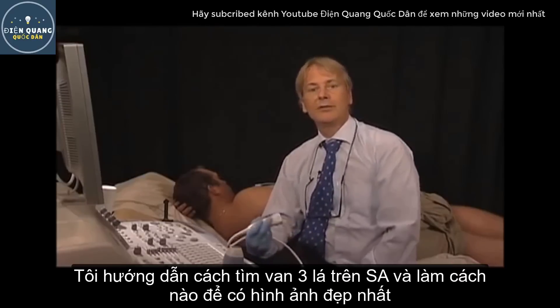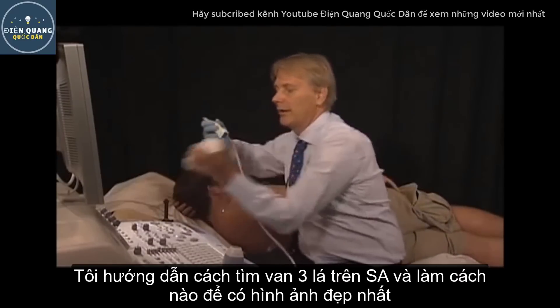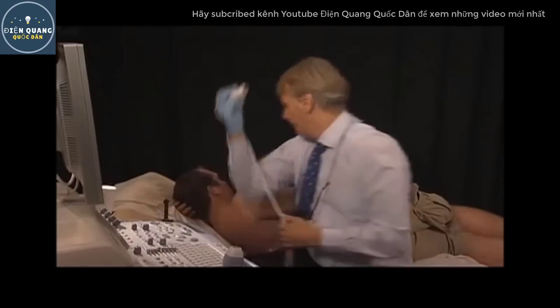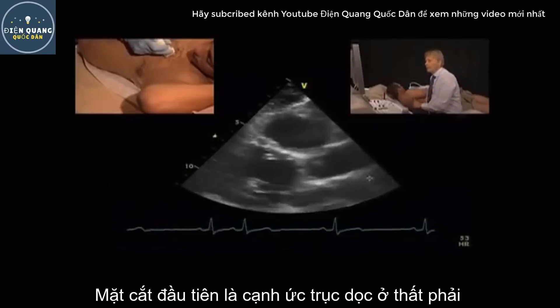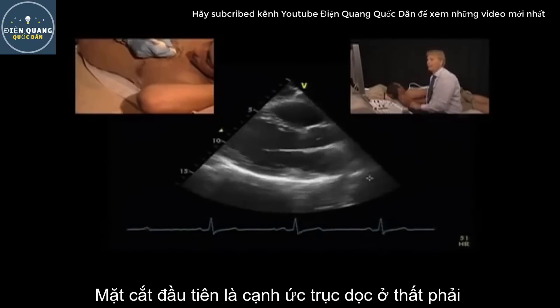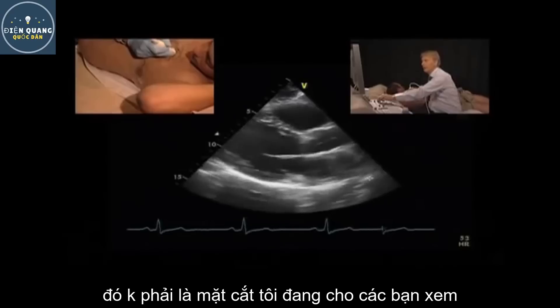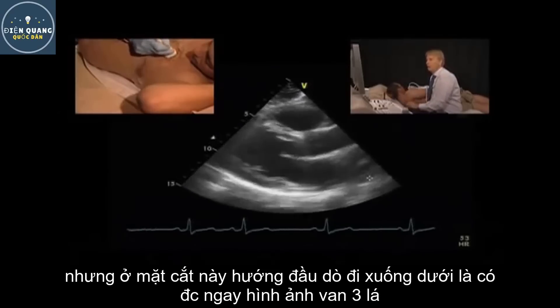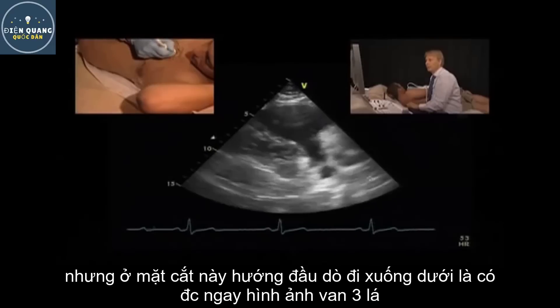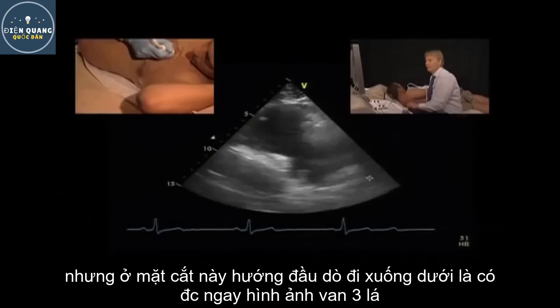I will show you how to image the tricuspid valve. There are several views where you can get good image quality. The first view is the parasternal long axis view of the right ventricle. This is not the view I'm showing right now, but it's a view where you tilt the transducer downwards from this view, and then all of a sudden you will get the tricuspid valve.